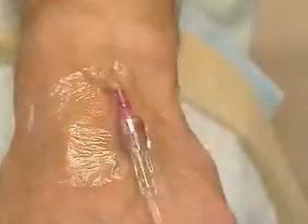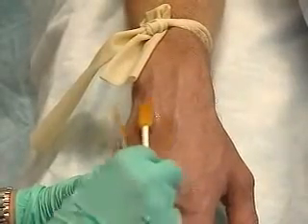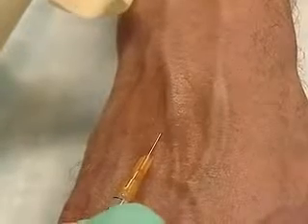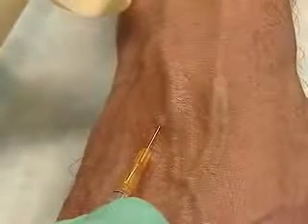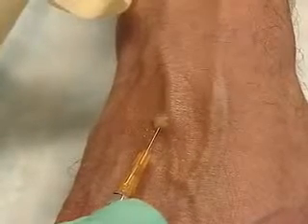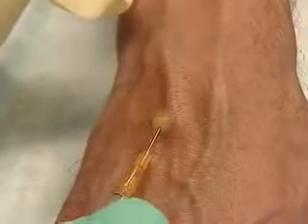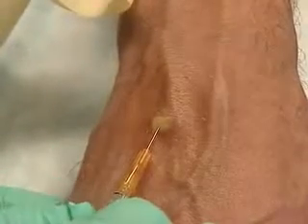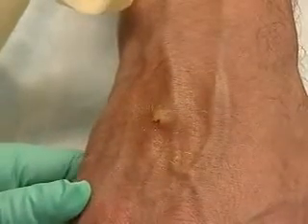The intravenous line insertion can be uncomfortable for some patients. If time allows, you can numb this delicate area with a subdermal application of lidocaine. You will inject just beside, not into the vein, and just below the surface of the skin. As it infiltrates, you'll see a wheal being created, a small protrusion, just enough to numb a small zone around the puncture site.